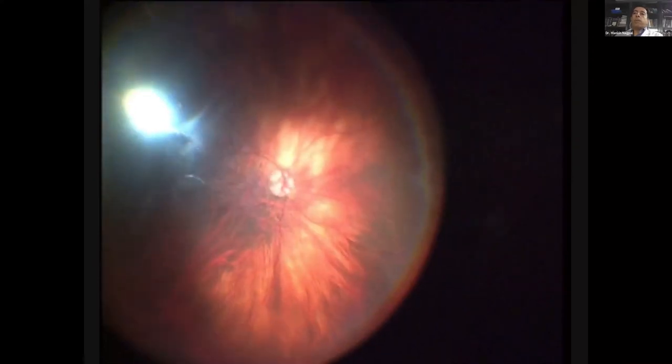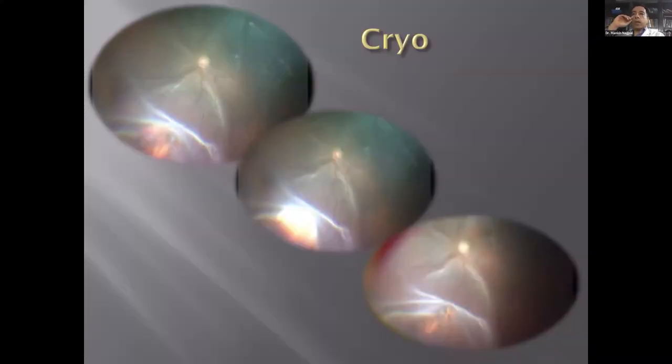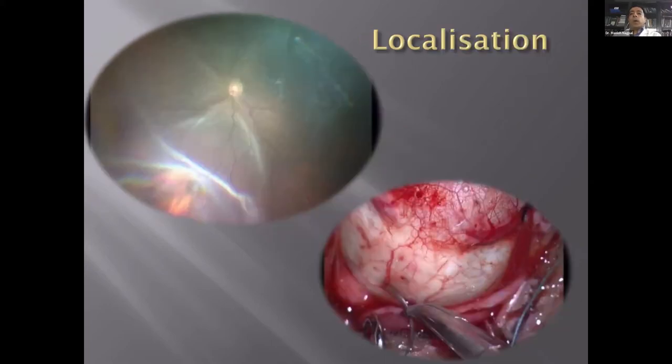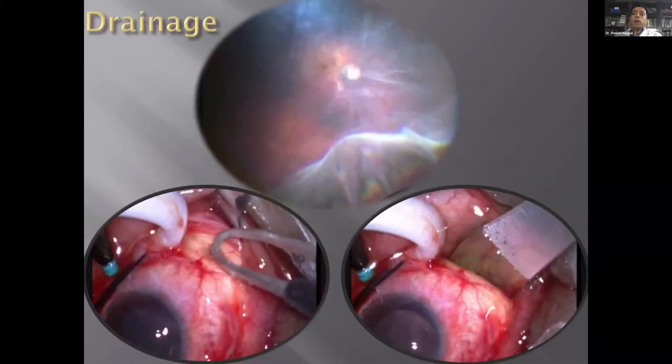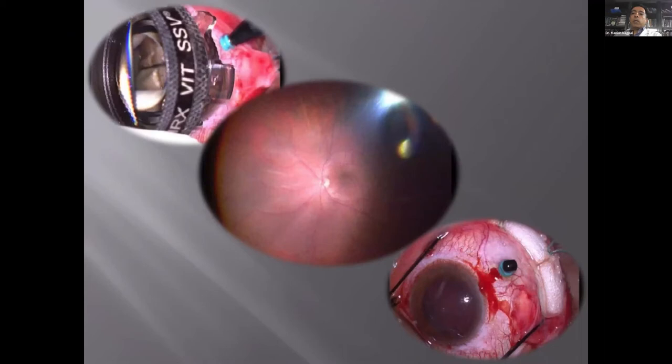With this system you have a much wider view, can zoom in where needed, and it's great for teaching — indirect ophthalmoscopy doesn't show much even with video. Here sequentially you see a break identified, cryo lesion applied and thawing, then external indentation. After cryo, we localize the break, take a marking suture, define the drainage area, drain it, put a buckle, and check the buckle effect. This is how a typical chandelier-based buckling surgery is performed.